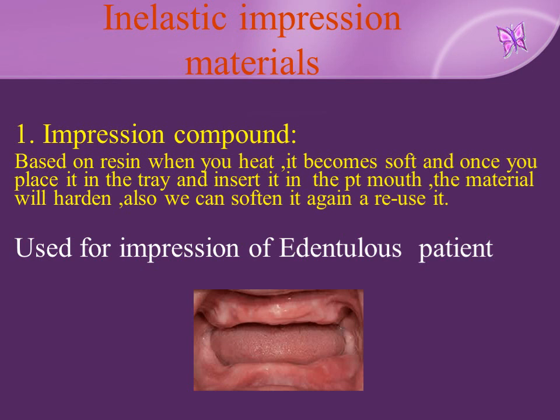Inelastic impression materials. Impression compound. Based on resin. When you heat, it becomes soft, and once you place it in the tray and insert it in the patient's mouth, the material will harden. Also, we can soften it again and reuse it. Used for impression of edentulous patient.